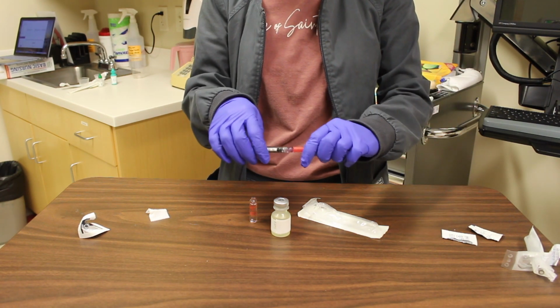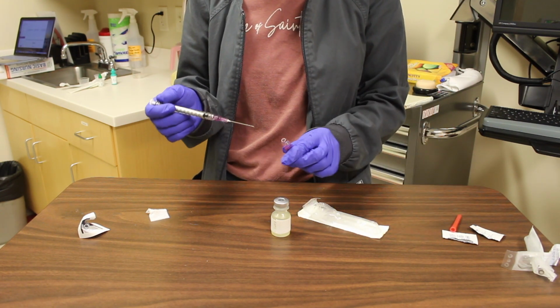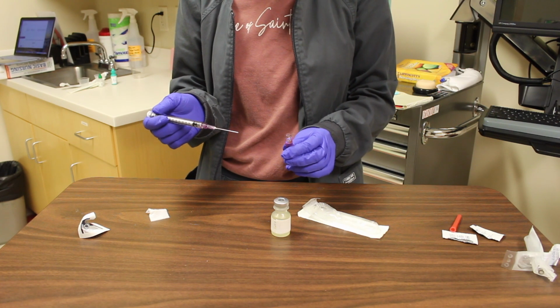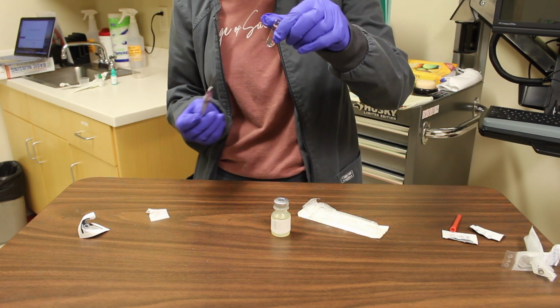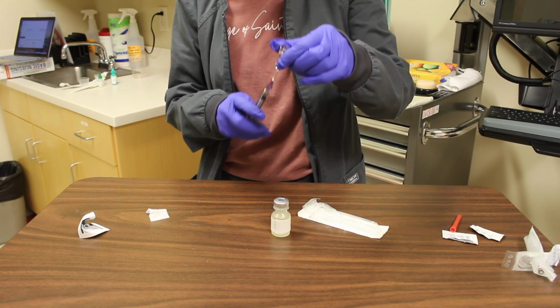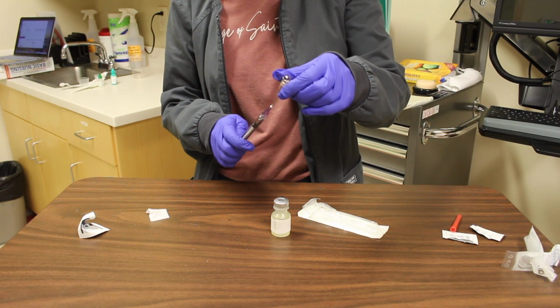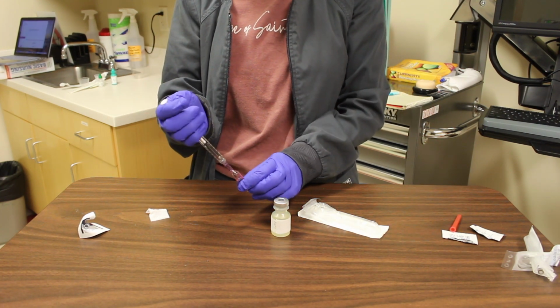Withdraw the medication from the ampule using one of 2 methods. For both of these methods, you will not inject air. One method is to invert the ampule, then place the needle in the liquid, withdrawing the medication. The other method is to hold the ampule in one hand and place the needle in the ampule, withdrawing the medication.